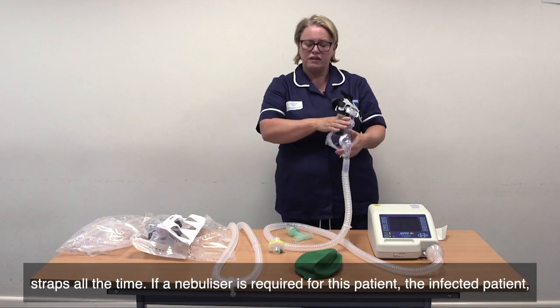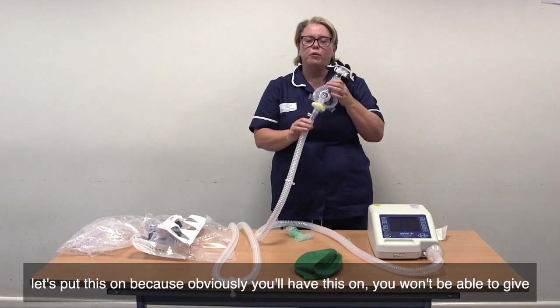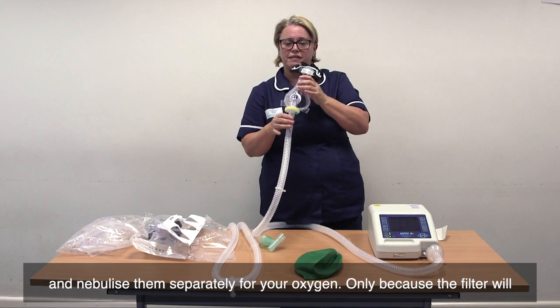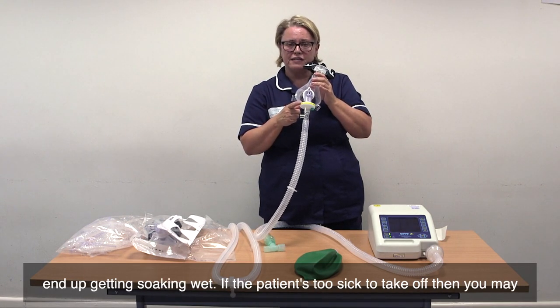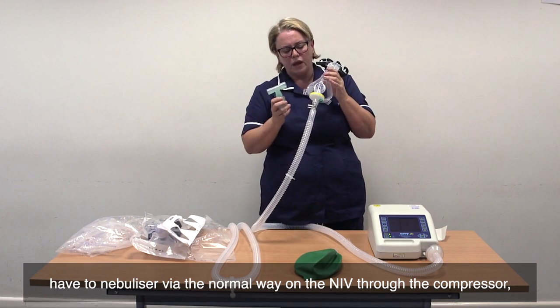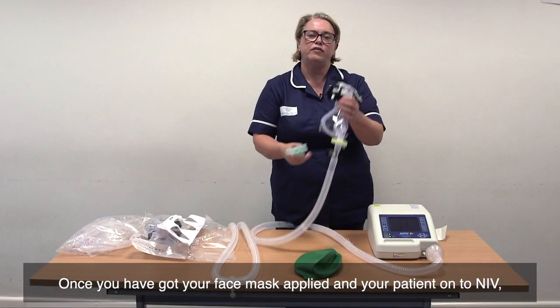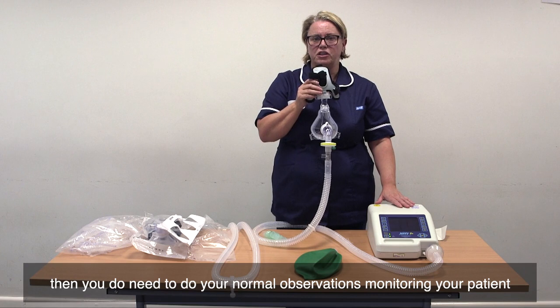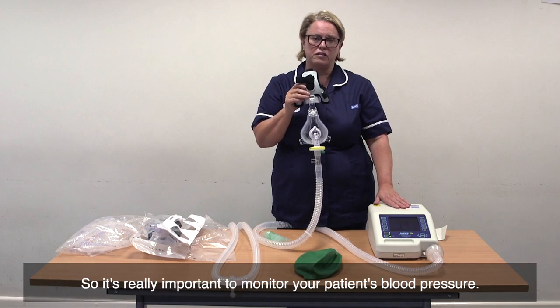If a nebuliser is required for the infected patient, you won't be able to give it like normal with the T-bar. You will have to take the patient off and nebulise them separately via oxygen, only because the filter will end up getting soaking wet. If the patient is too sick to take off, then you may have to nebulise via the normal way on the NIV through the compressor, but you will have to change your filters regularly. These filters must be changed every 24 hours. Once your face mask is applied and your patient is on NIV, you do need to do your normal observations, monitoring your patient at all times, because whilst on CPAP it can affect blood pressure — so it's really important to monitor blood pressure.